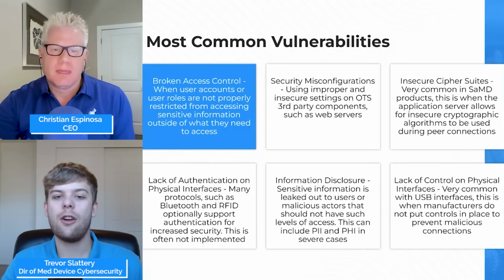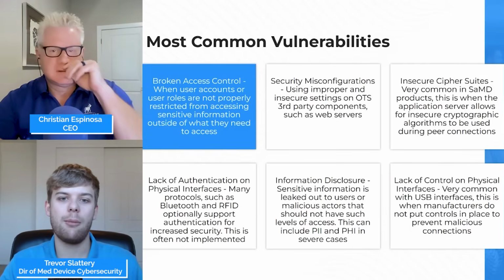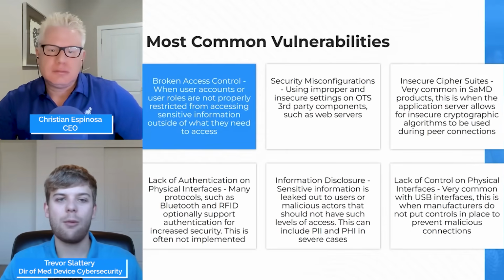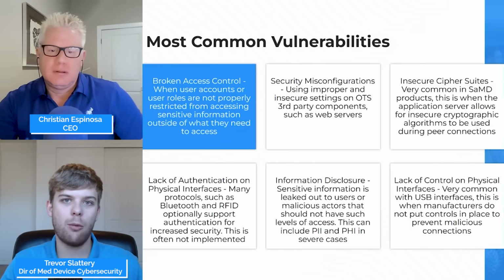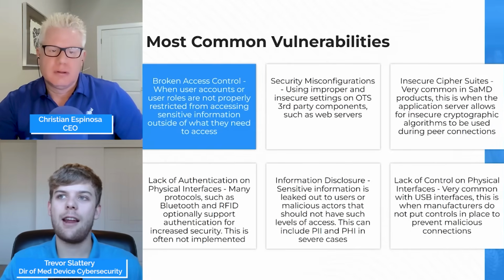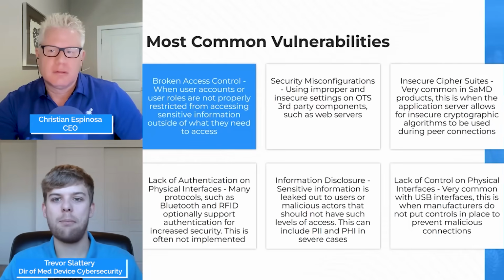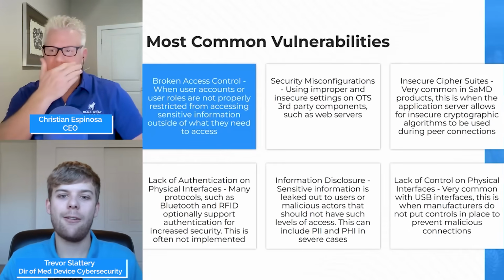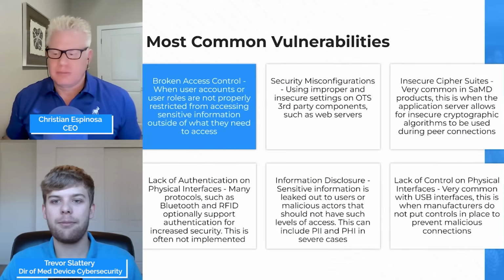Another very common thing is security misconfigurations. This is using improper or insecure settings on off-the-shelf third-party components, like a web server. The reason I bring up web server as an example is by default, a lot of web servers disclose information about what components are in use, information about the web server, and they leave it as server headers, which anyone can see in the open. Now, considering that a lot of software as medical device products use web servers for hosting, this is a very common problem that we see. Security misconfigurations, of course, can be a very broad umbrella of problems. However, this is an easy example and something that we'll see on most penetration tests against SAMD products.